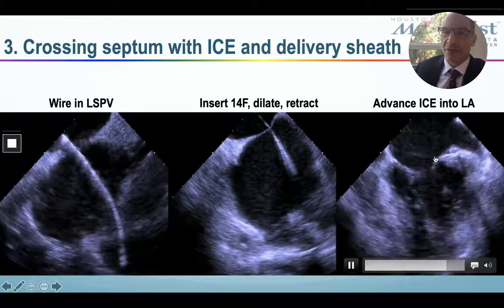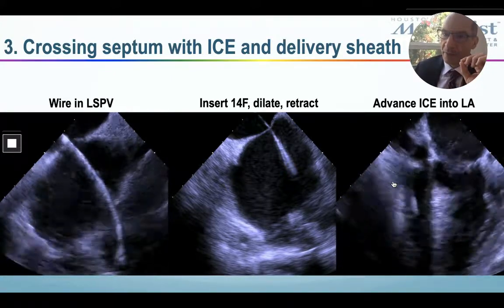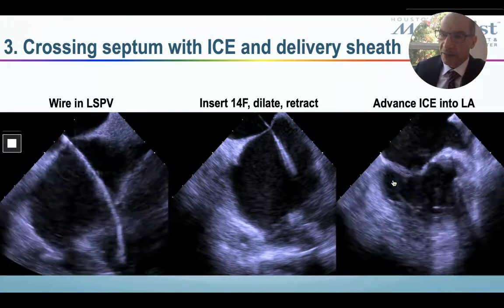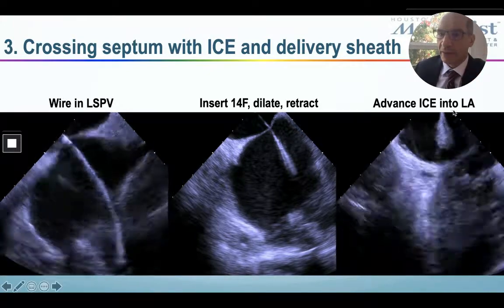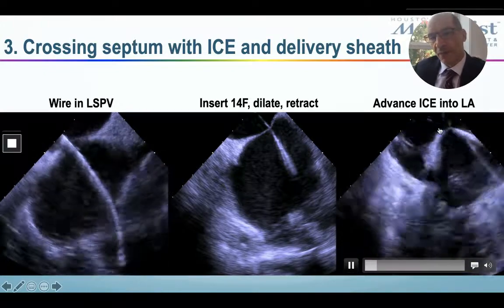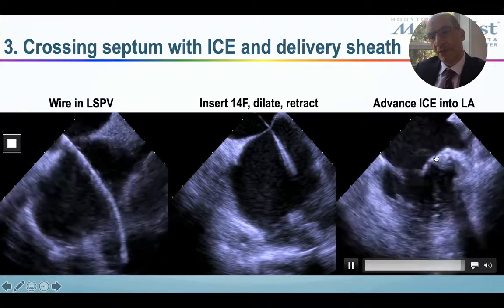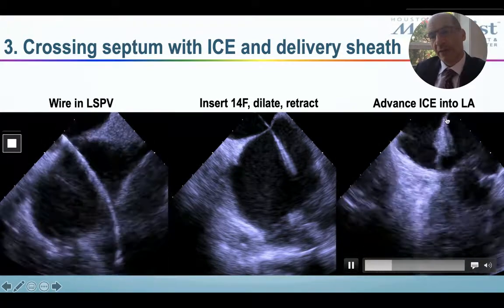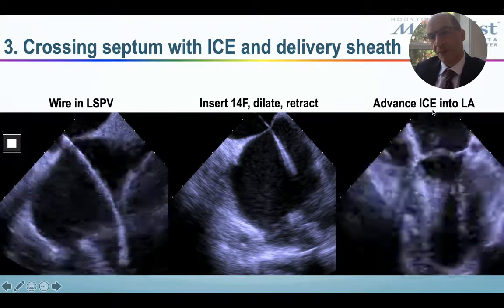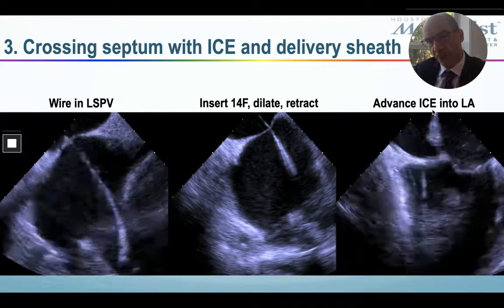And this is one of my favorite things to do, which is to advance the ICE catheter, the ICE probe, into the left atrium, simply following the wire. It looks very difficult, but basically as you bend the ICE catheter, you will see the wire coming to the vertex of your image, and that means you're right there, and then you advance towards the left atrium, and there you go.